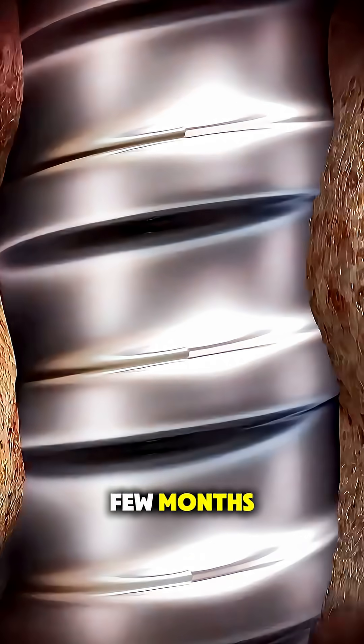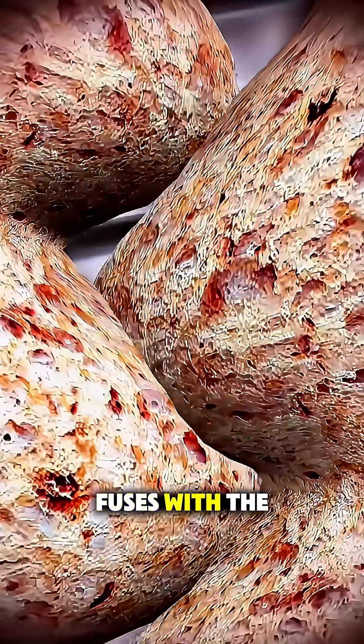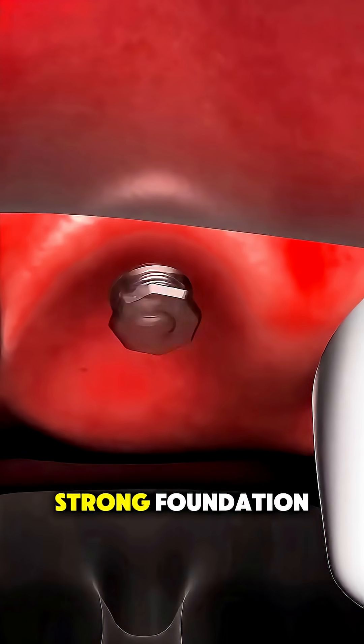Over the next few months, the bone actually fuses with the implant in a process called osseointegration, creating a super-strong foundation.